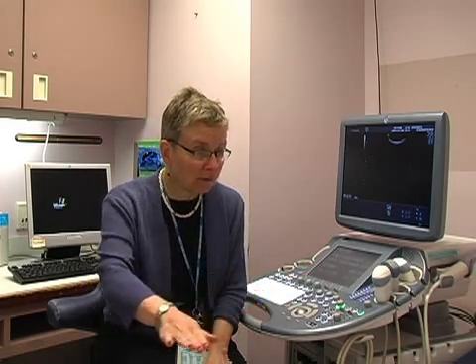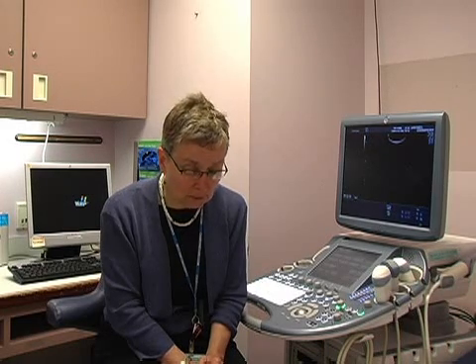You should demonstrate attentiveness to your patient's comfort. In general, an obstetric patient will lie flat or supine on the table, but as pregnancy progresses, patients will become increasingly uncomfortable lying flat on their back. You may need to position them so that they have a left or right lateral tilt depending on which fetal structure you're imaging at that time.